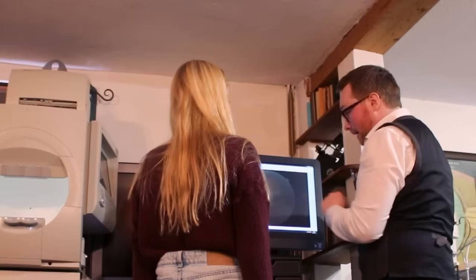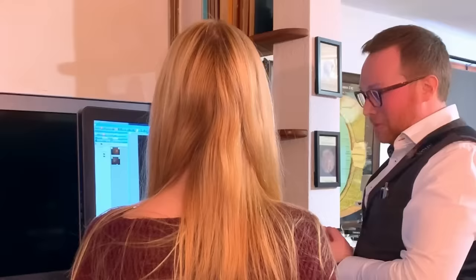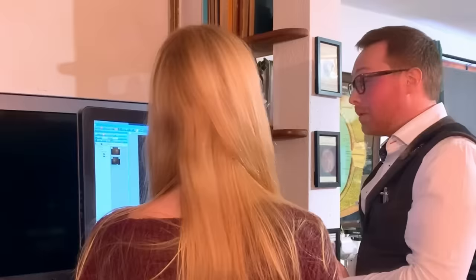But photographs are a really good way of cataloguing the back of your eyes, the general health. A picture says 1,000 words, and trying to condense all of this into a small written description is not easy, so a photograph is by far the best way of cataloguing your eye health. But all looking very good so far.